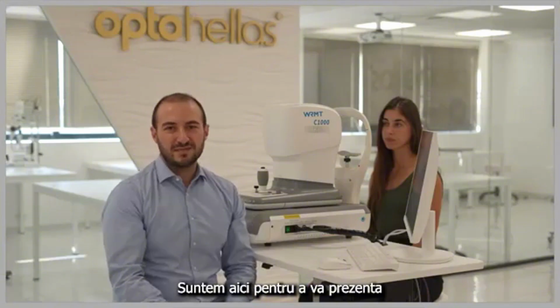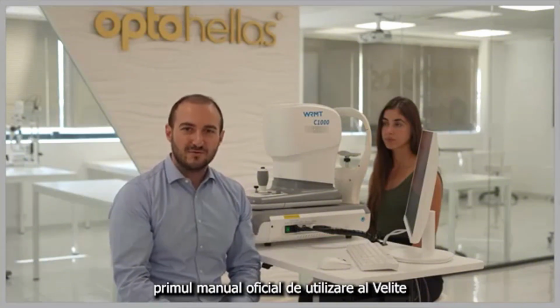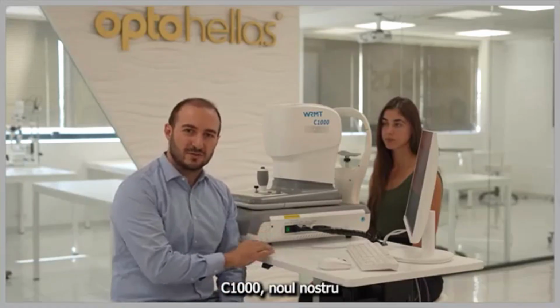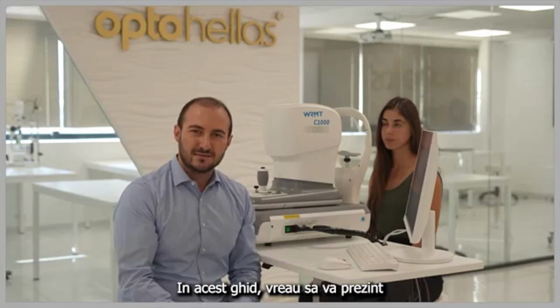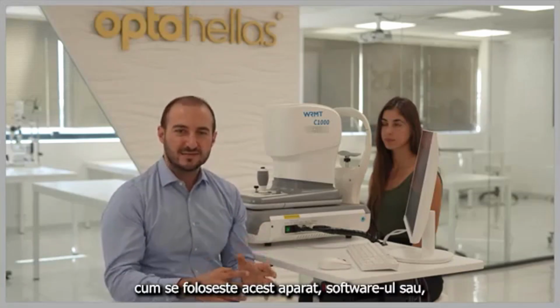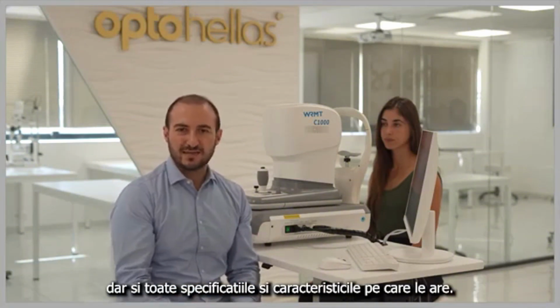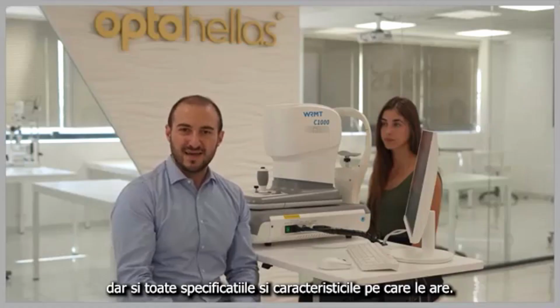We are here to present you the first official user's guide of Velite C1000. Velite C1000 is our new SLO ultra-wide OCT, and in this user guide I will show you step by step how to operate the device, how to use the software, and all the official features and characteristics of the device.